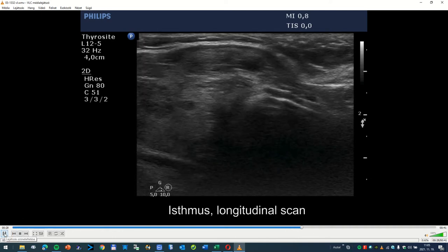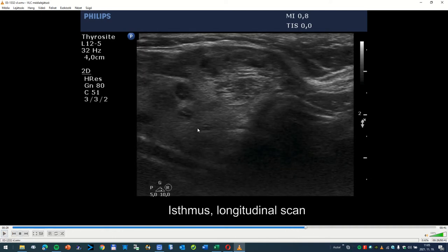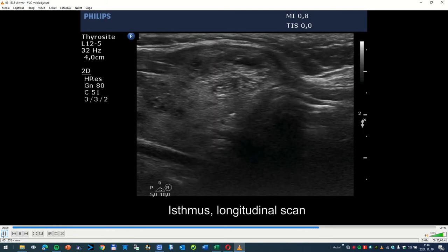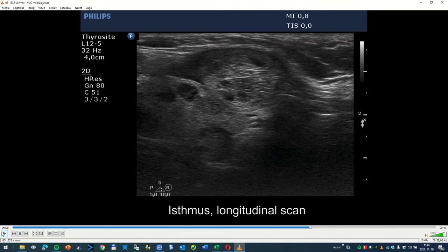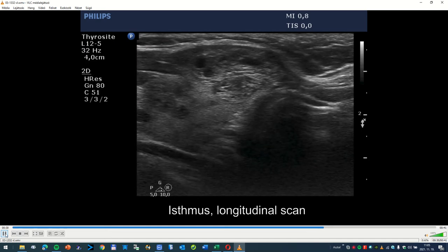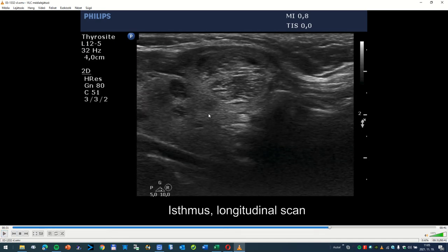Here in the left lobe, or in the isthmic part of the thyroid, we can see the characteristic presentation of back wall figures. These are all located dorsal to cystic areas. This presentation should not cause concern. We can also see echogenic granules within this lesion, but the simultaneous presence of echogenic granules and lines with similar echogenicity and similar brightness should not cause concern.